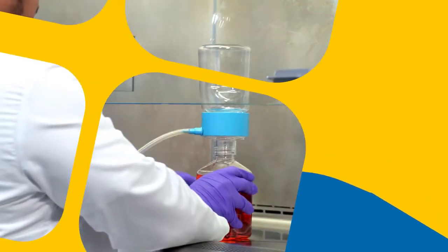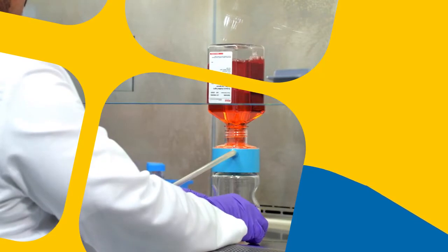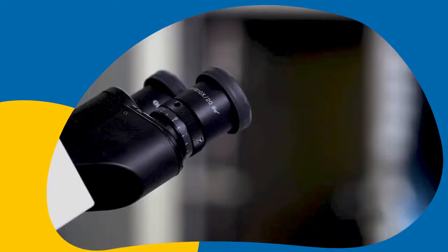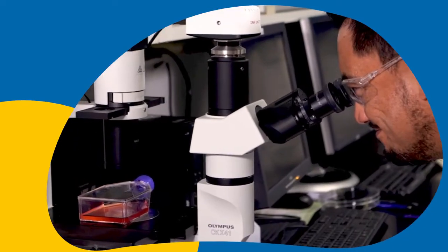The SteriCup E and SteriTop E devices use the same PES membrane most life scientists select for the fastest filtration, and the SteriCup E and SteriTop E products provide the same quality-tested, reliable filtration that's the basis of healthy cultures and reproducible results.